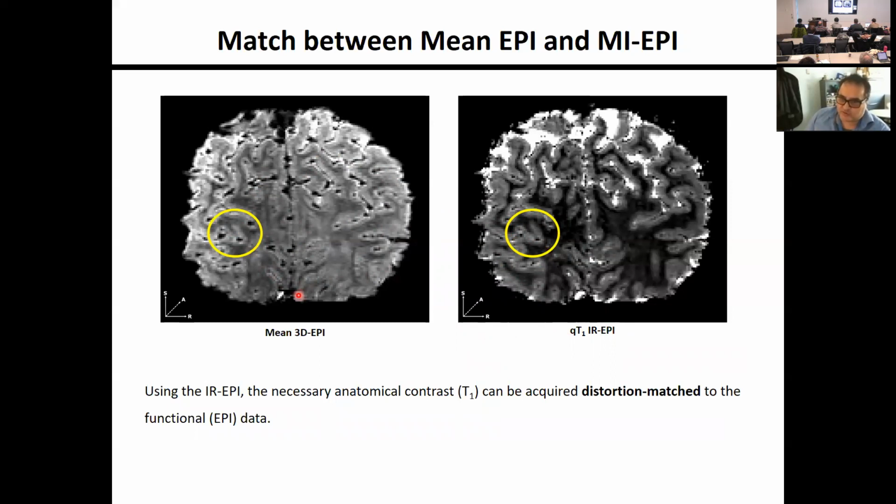Now, we cannot always trust our visual inspection because we have only limited capacity to observe the images. So we need a better way of evaluating how well the registration and segmentation have actually worked. And there we run into a difficulty because we don't have any gold standard. We can perhaps do some realistic phantoms, but phantoms might not be generalizable to the human brain.